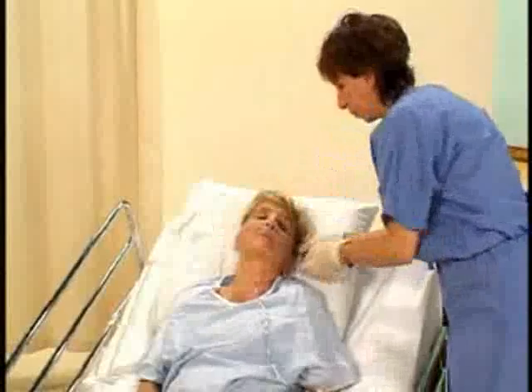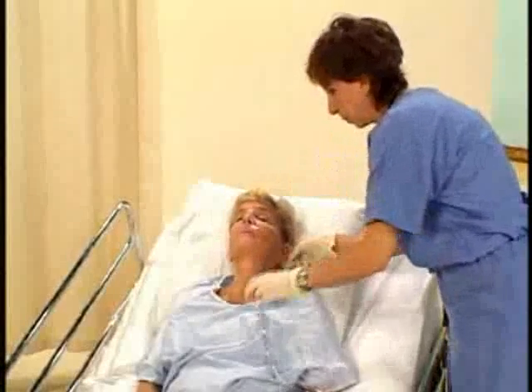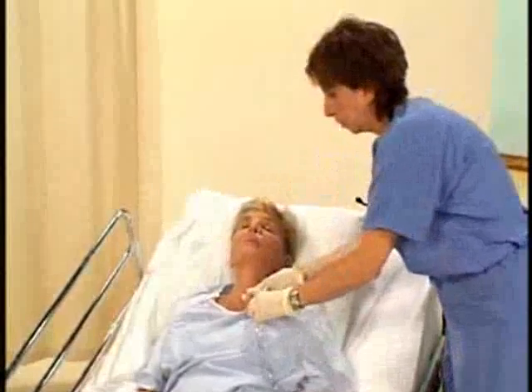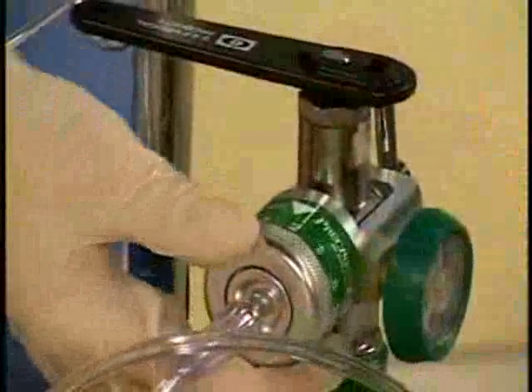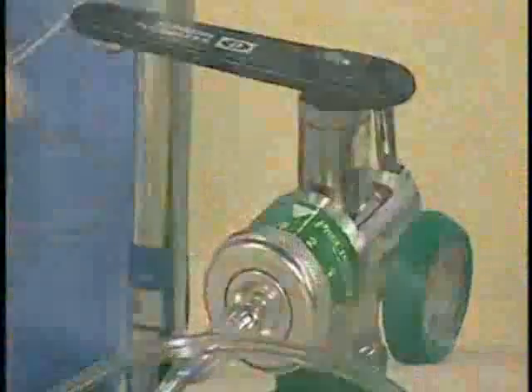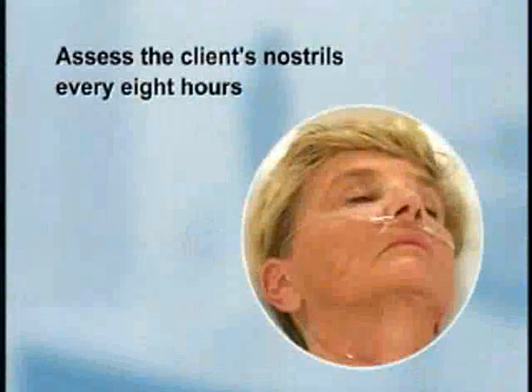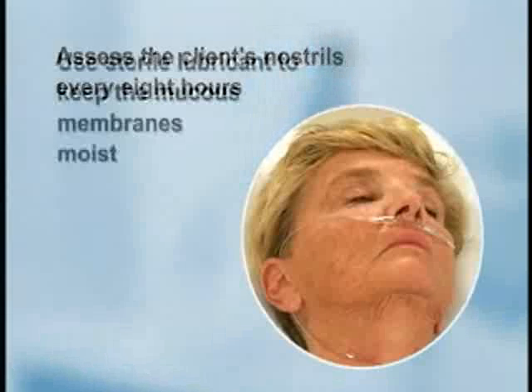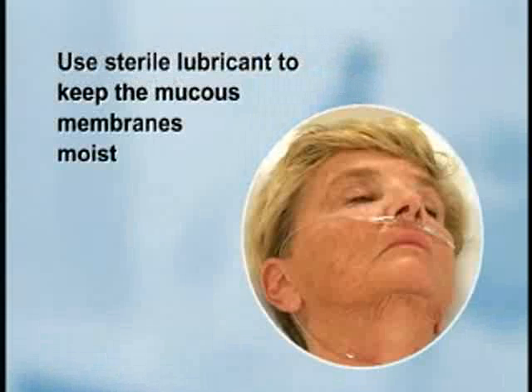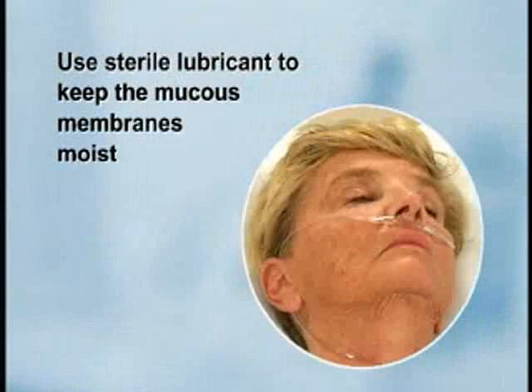Place the nasal prongs in the client's nostrils. Secure the cannula in place by adjusting the tubing around the client's ears and using the slip ring to stabilize it under the client's chin. Check for the proper flow rate every four hours.